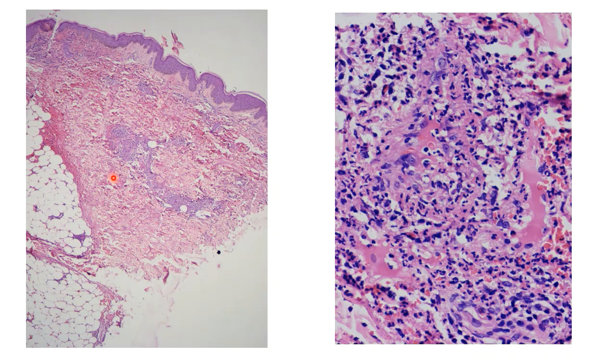It is a picture of urticarial vasculitis. Here we can see the upper dermis with the extravasated RBCs. On higher magnification, this vessel wall shows evidence of leukocytoclastic vasculitis with the endothelial swelling and fibrin deposition, and it also shows extravasated RBCs and associated perivascular dense neutrophilic infiltration.